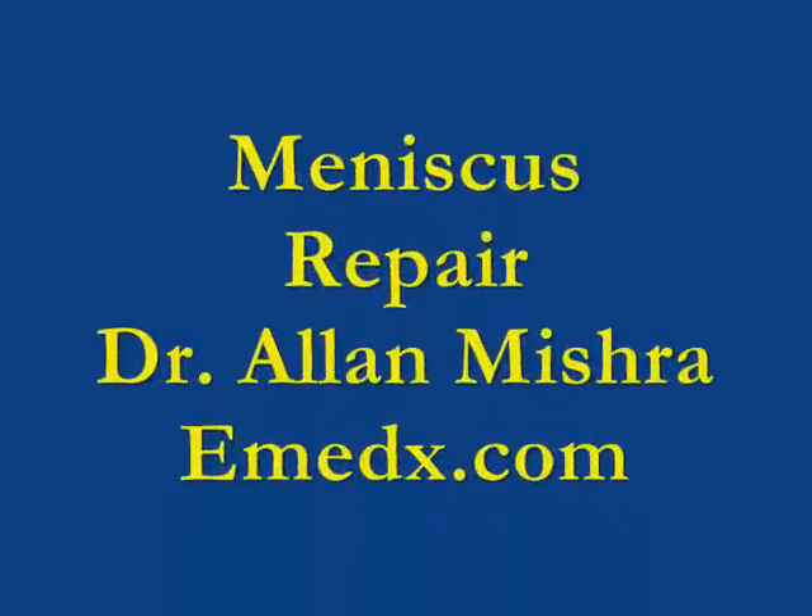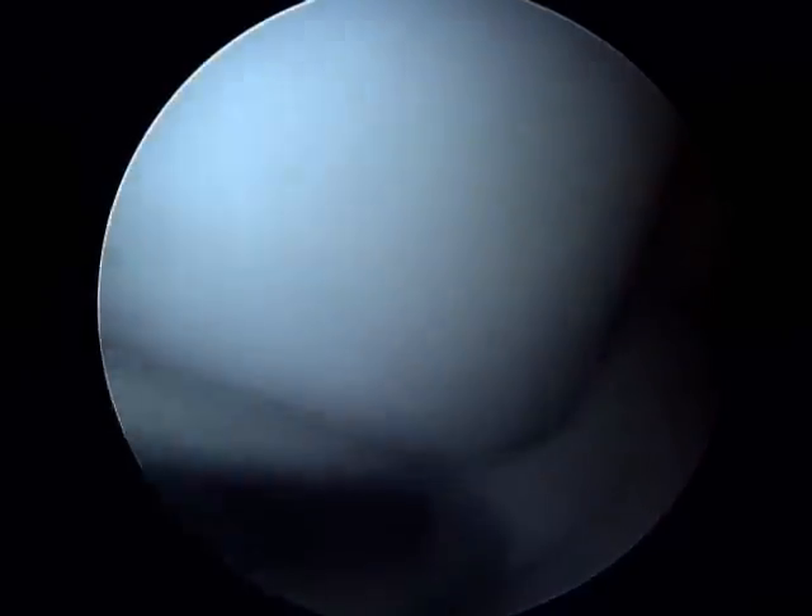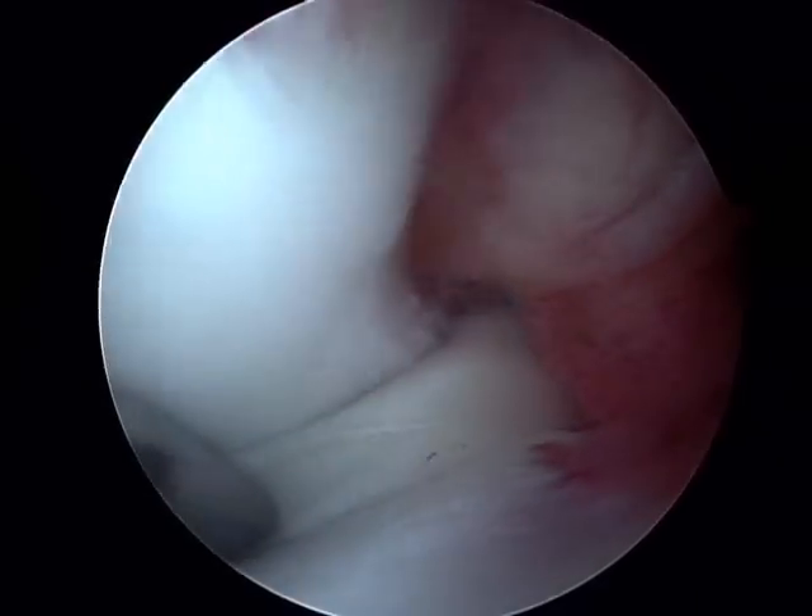My name is Dr. Alan Mishra and this video will demonstrate a meniscus or cartilage repair. This is a bucket handle tear of the medial meniscus which is then reduced into position using a probe.